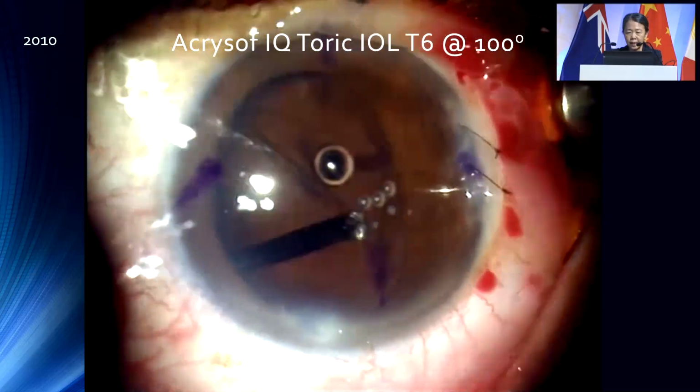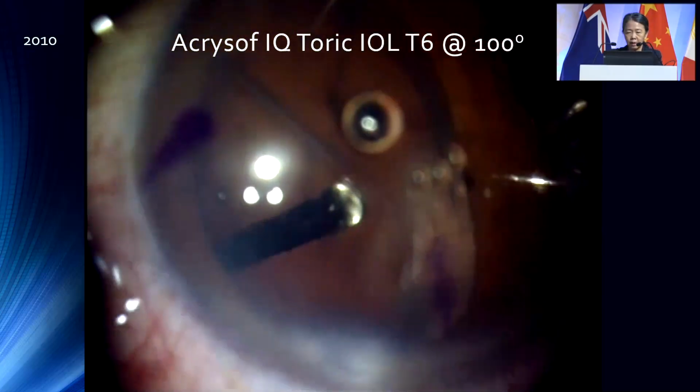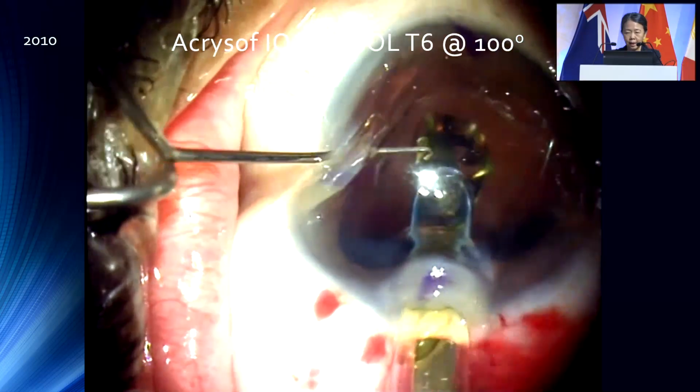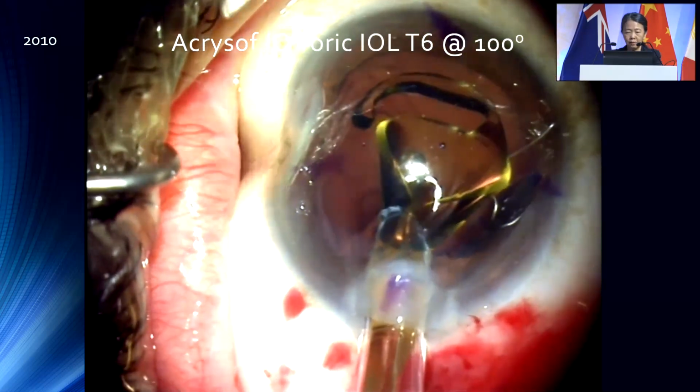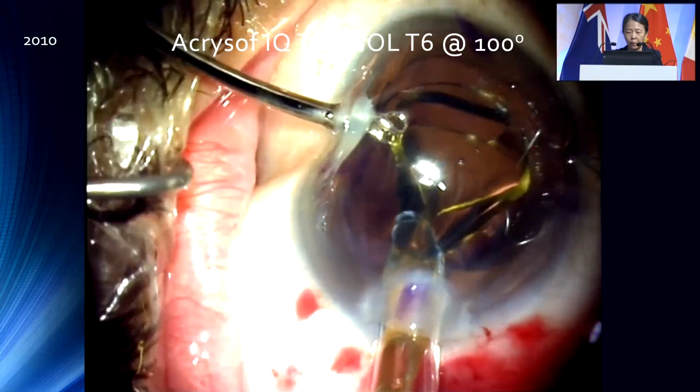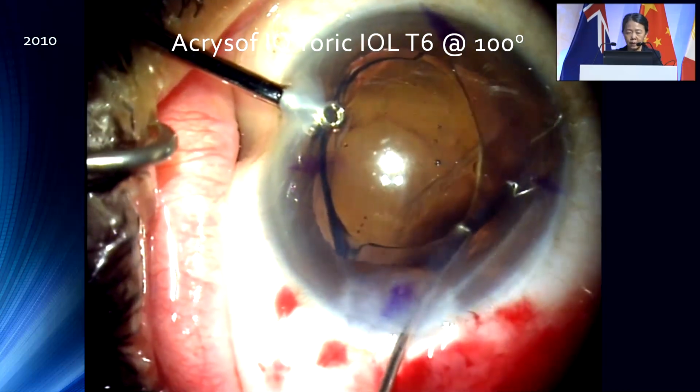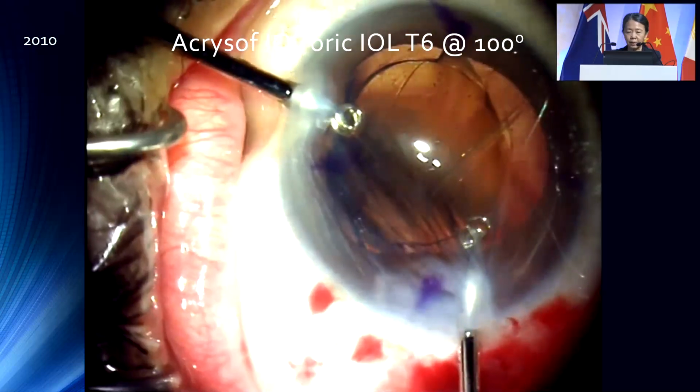Let's have a look at this case now. This is a lawyer who wants to go to court the next day, and I had a small fragment that dropped, and you saw that rip in the posterior capsule. And my retina colleague was just about to walk out. I said, just wait, I have to put in this lens for him.